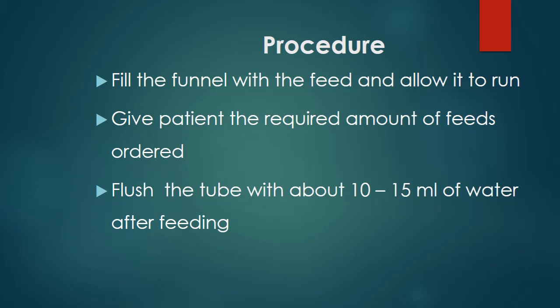Then after the feeding process, you flush the tube with about 10 to 15 ml of water. This is very, very important, which at times most nurses tend to ignore. But I will advise that in the course of your practice, always keep this in mind. The food that we give, some of it will solidify over time. So if we fail to flush the tube after feeding, there is the likelihood that the food particles will cling to the surface of the tube, ending up blocking the tube.